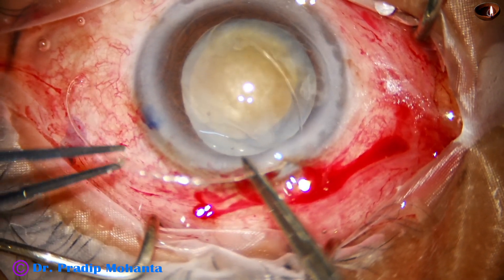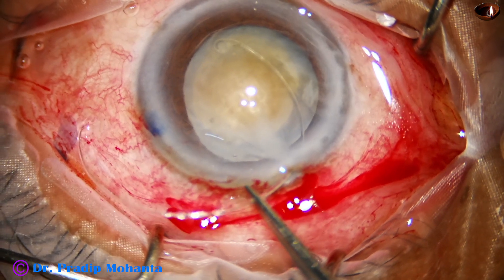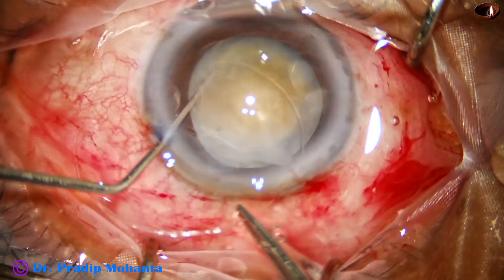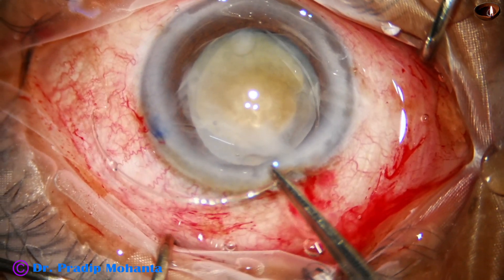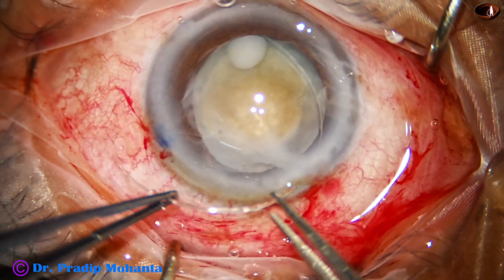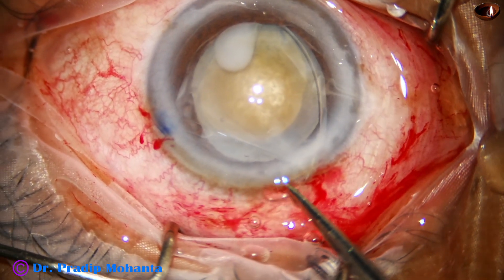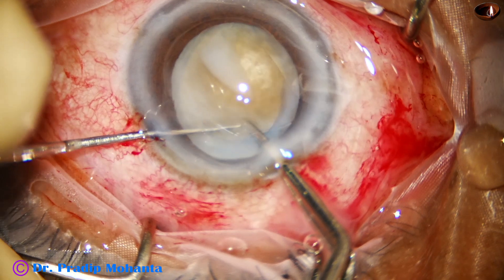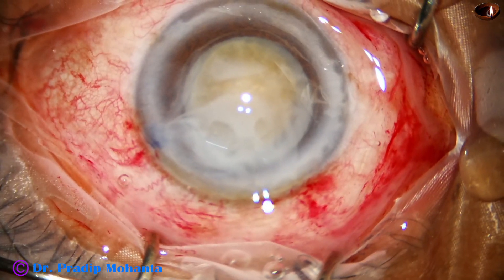The leading end of the CTR goes through the main wound. It must be confirmed that the leading end passes under the anterior capsular rim. A Sinskey hook is used to depress the leading end and push it into the capsular bag. Using a bimanual technique with McPherson forceps, the ring advances into the capsular bag. The Sinskey hook prong goes through the eyelet to complete CTR placement.